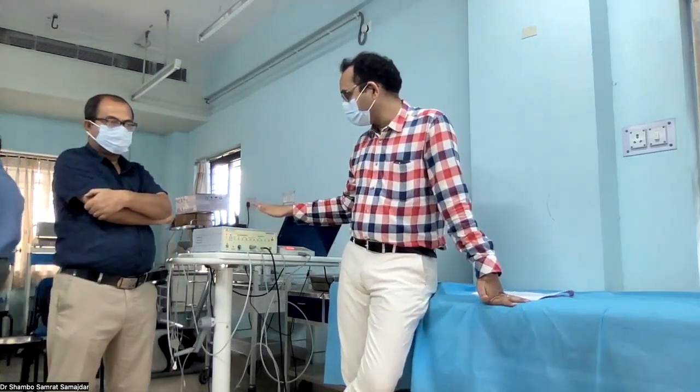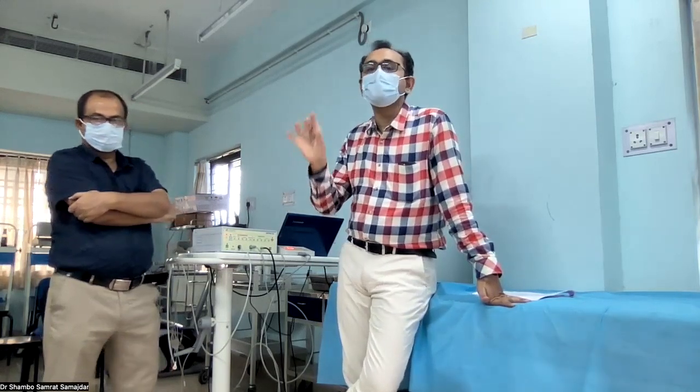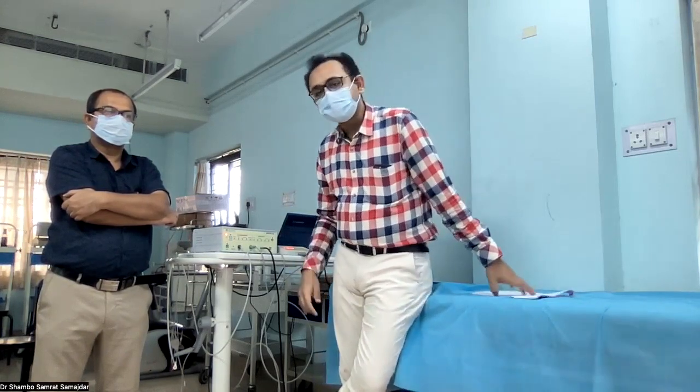But now we will demonstrate how we can do it over the machine, and that machine also gives us another information regarding heart rate variability by analyzing the RR interval changes and translating it into waveform analysis, giving values of LF, HF and VLF. That means low frequency, high frequency and very low frequency values of RR interval changes. So let's start our test.